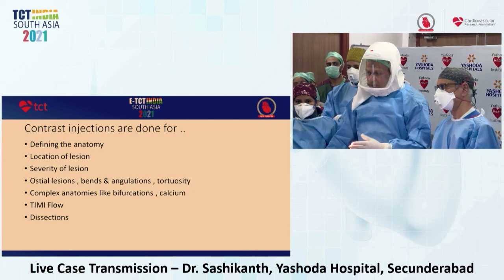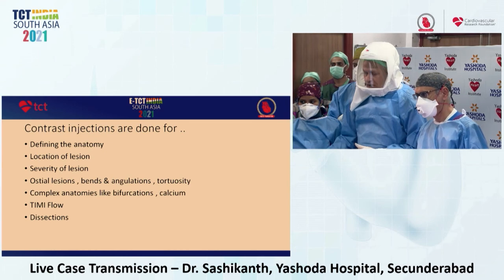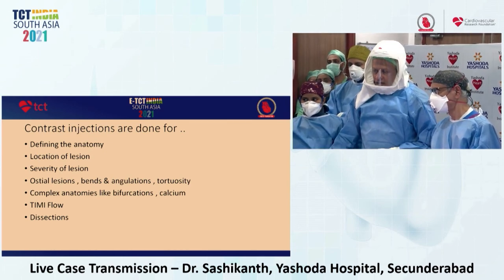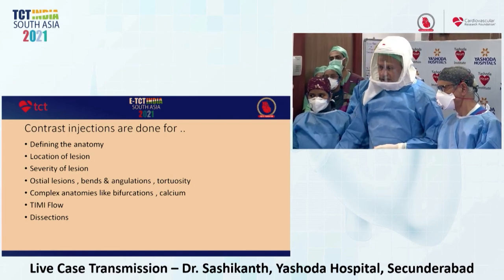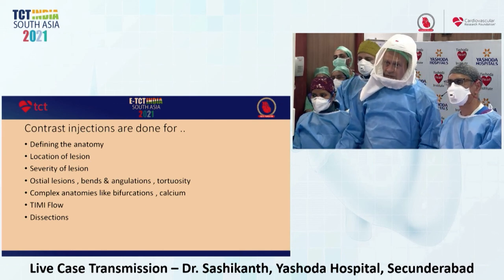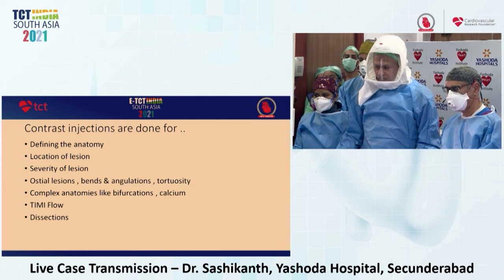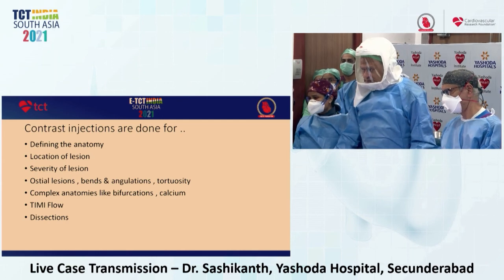So here we have a patient who had an acute kidney injury, and the creatinine is not settling down in spite of 1 month of waiting. So we thought we should be doing a low volume contrast PCI, especially when the patient had a CVA recently and he's a high risk individual, and the family is not accepting a surgery and also not accepting renal replacement therapy if in case needed post bypass surgery. Those are the strong indications we had to think about this.